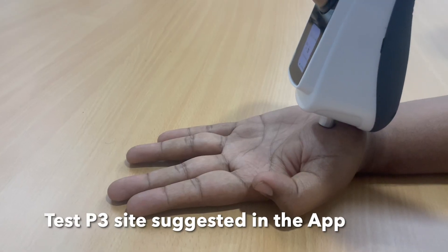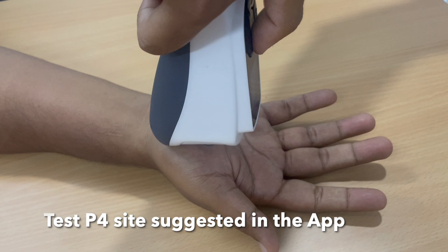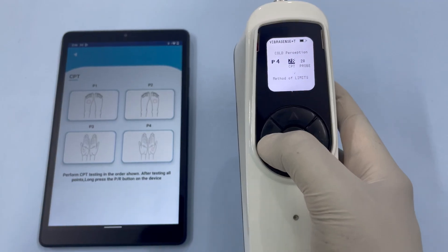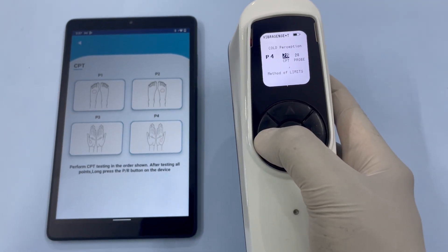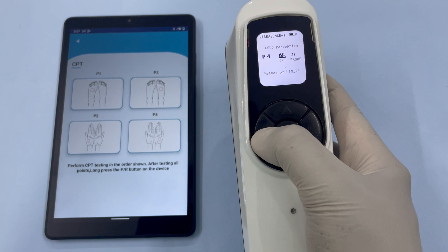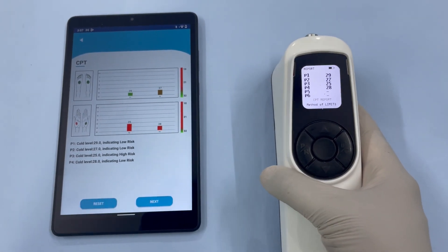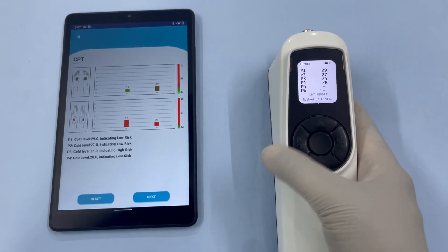Once all four points have been tested, you're ready to save the data. Bring the device close to the phone and long press the PR button. This will generate a CPT summary report on the device screen and also send the CPT data to the app, where the CPT report, including a graph, will be generated.